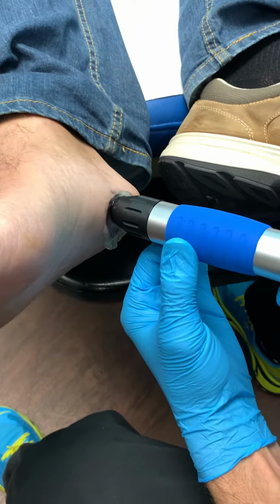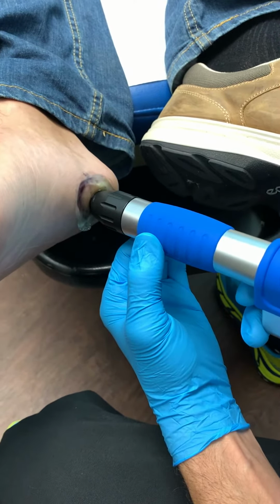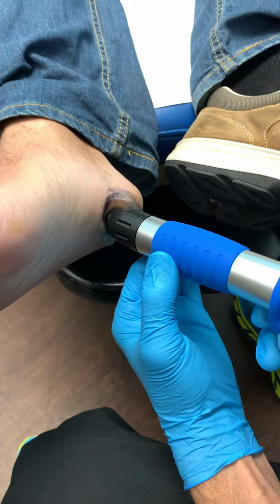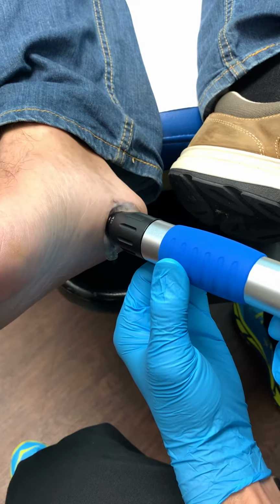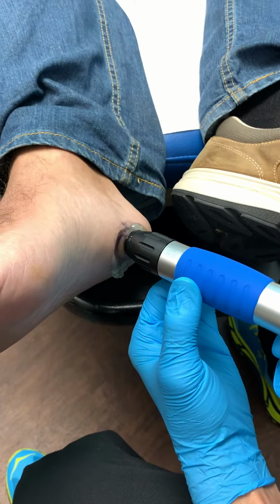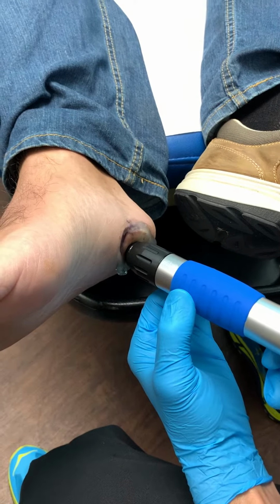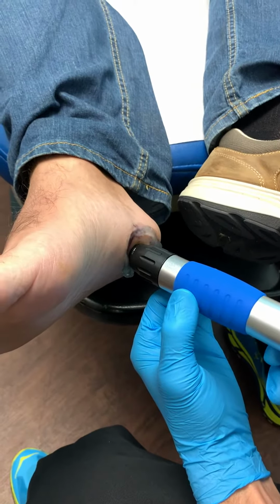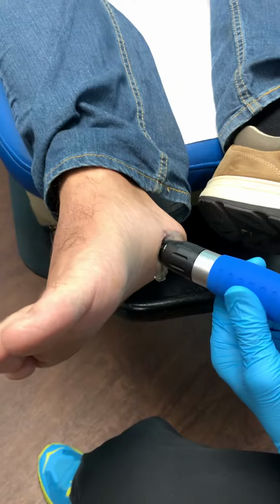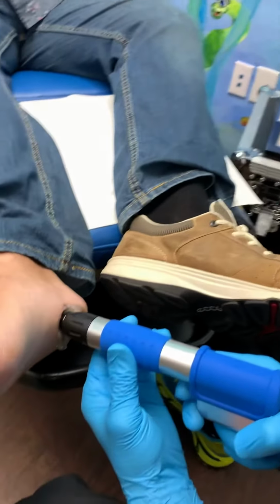This is really a great alternative. It's non-invasive. It's FDA cleared. This procedure is not covered by any insurance. I'm going to put that out there. We're going to stop here a second. I'm going to beef up the energy a little bit.